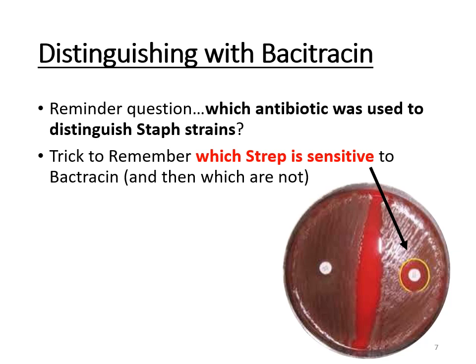So you would streak bacteria on a plate, place a disc containing Bacitracin in the center of where you streak that bacteria, and if you see a zone of inhibition, a big circle around that disc, you know that there's pyogenes there, whereas E. faecalis and agalactiae will not have that zone of inhibition because they're resistant.